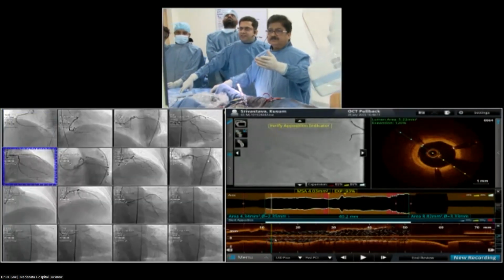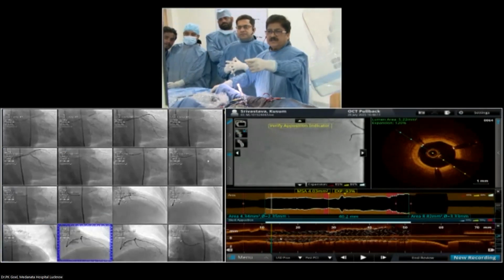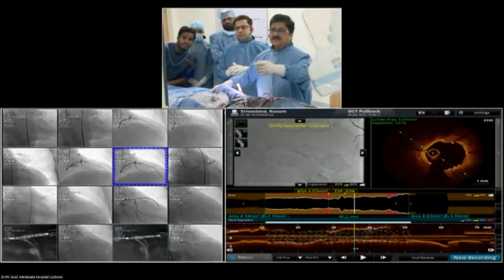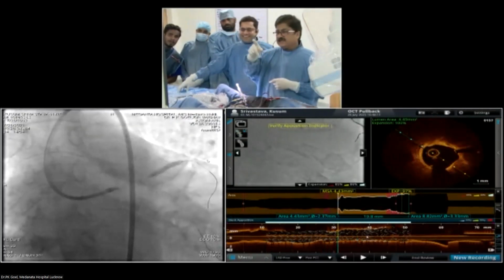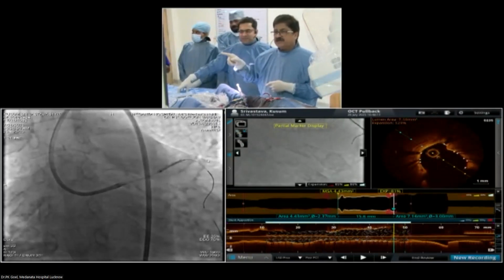We were going to stent the LAD. Okay, we did the LAD stent. Start here. No, above. Just start it. Let us start, we'll run it through. Move. So that was the LAD stent. They are not listening to you. Am I audible? Yes, very well.